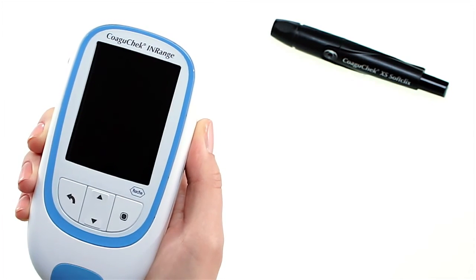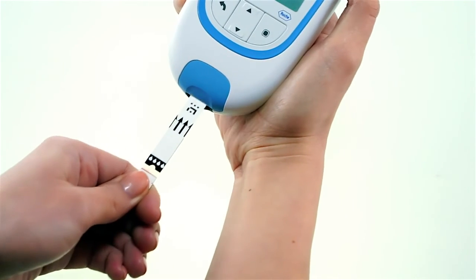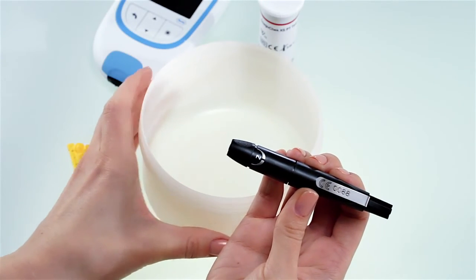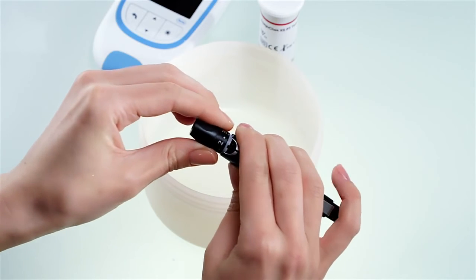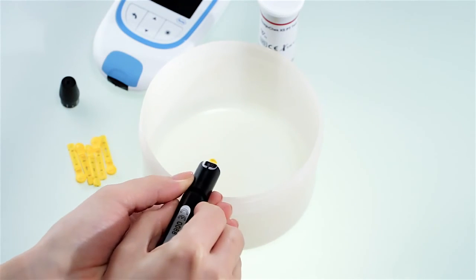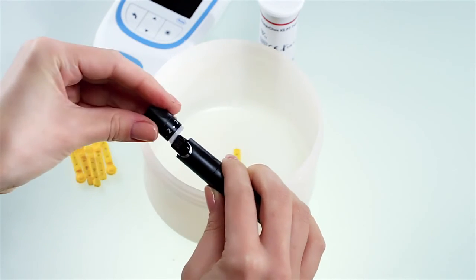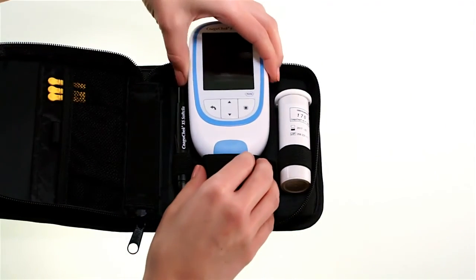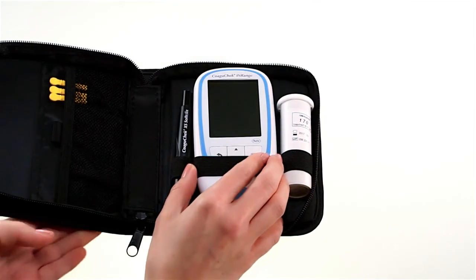Now, two important final steps. First, dispose of the used test strips in your regular household waste. Then, carefully dispose of the used lancet so that it cannot cause injury to yourself or others. Use a sturdy sharps container with a lid. Remove the cap and point the lancing device into the sharps container and slide the ejector forward as shown, then place the cap back on the lancing device. Remember to store everything in the carrying case for the next time you need to test. You will find more information in the user's manual.